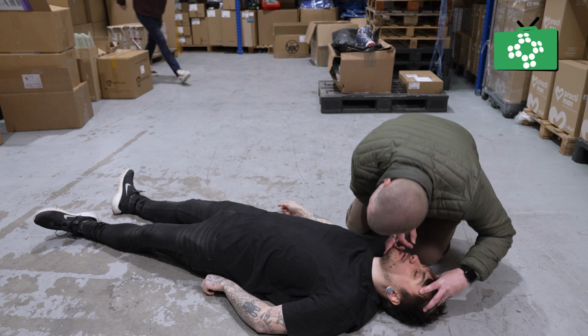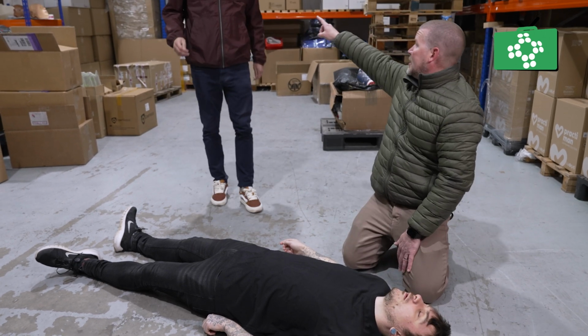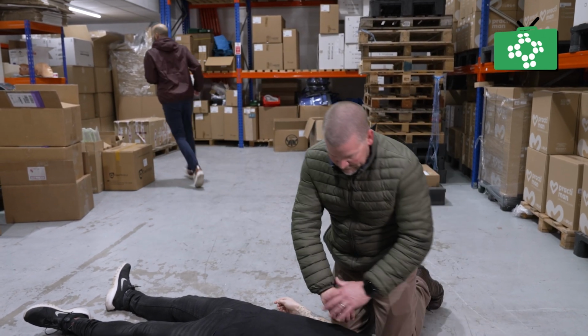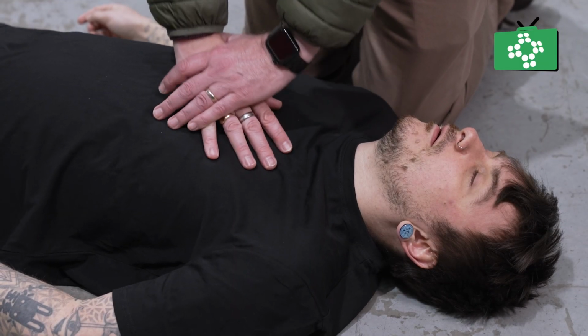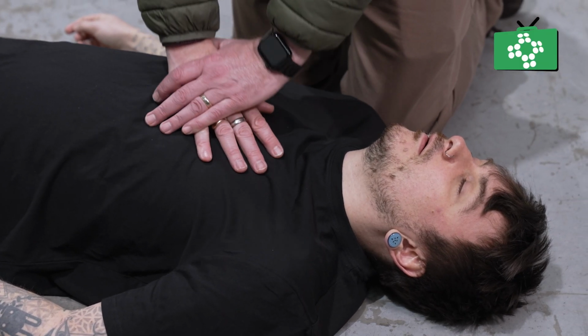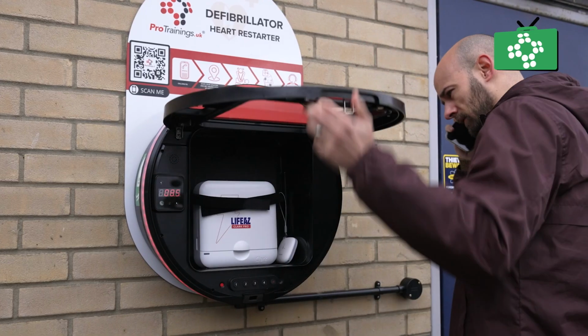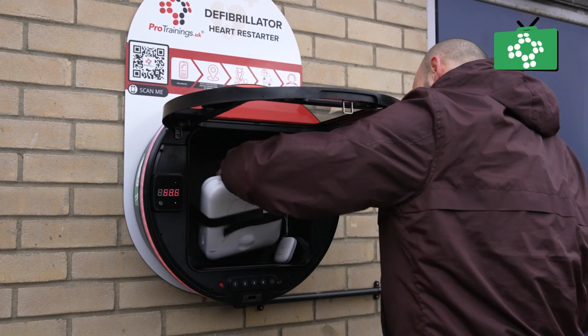So if someone is there to help, send them to activate the emergency services and fetch the AED unit as quickly as possible. If you're alone, then you need to call EMS, which you can do with your phone on speakerphone while delivering chest compressions. Continue CPR until the AED arrives.